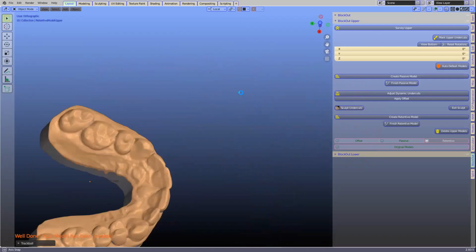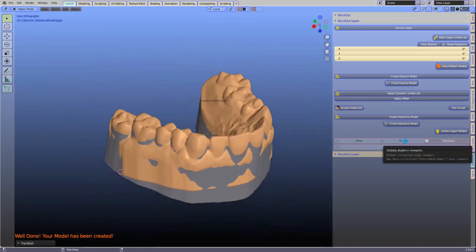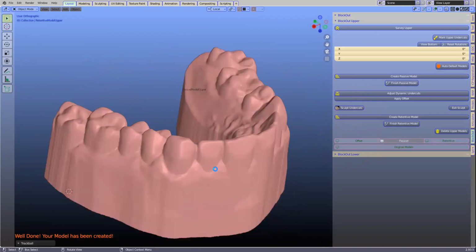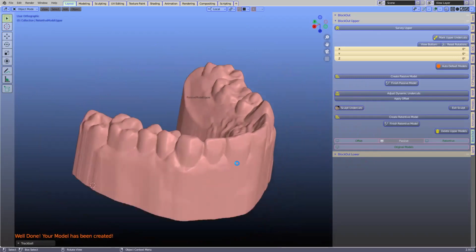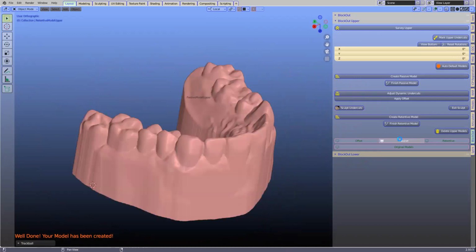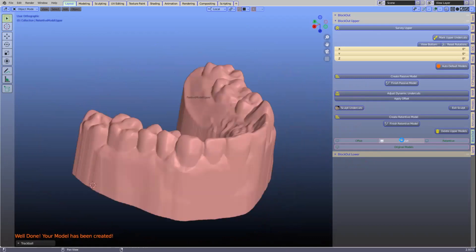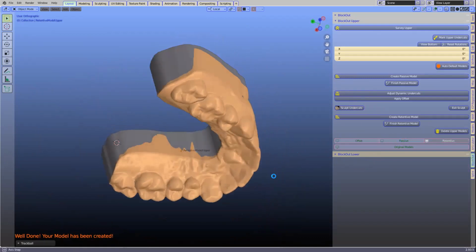I just want to come back to the 3 models. One of them is a passive model, which we use for implant guides. And this is the passive model. It looks like when you're making a chrome cobalt in the lab, you've blocked it all out. And this is kind of a pink. So that's used for guides. And the offset is used for just a rubbery material. And the retentive model, we call it, is that one, because that's got retention.